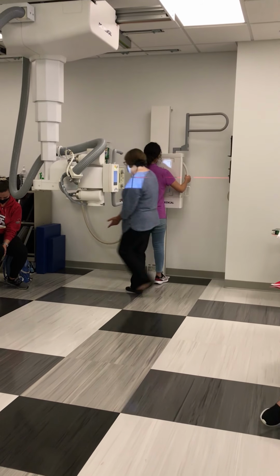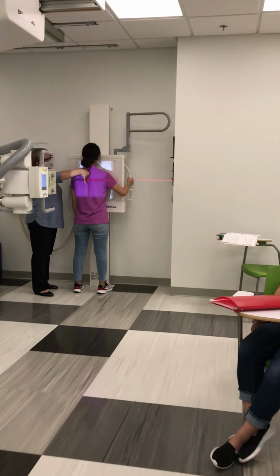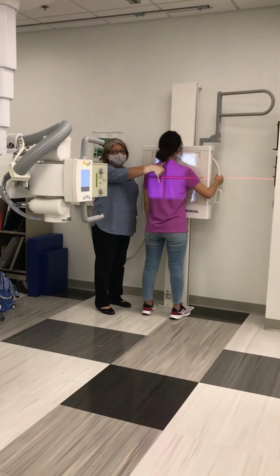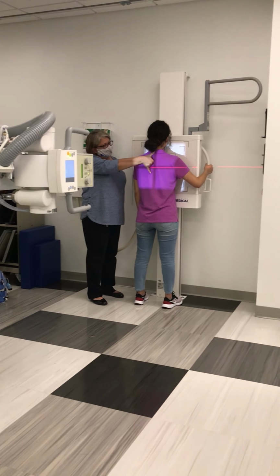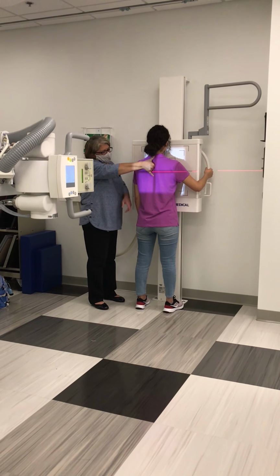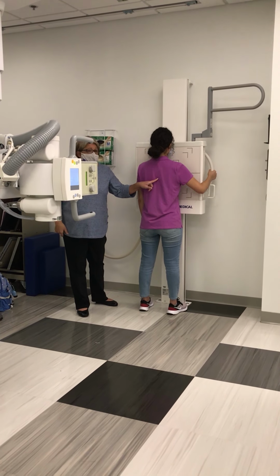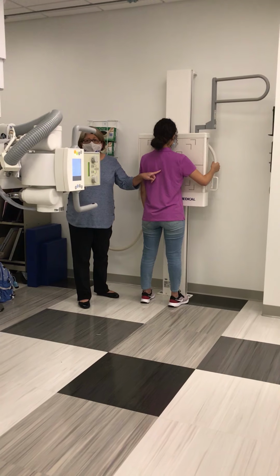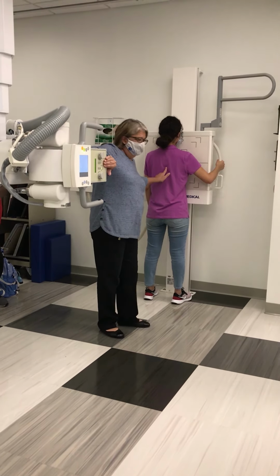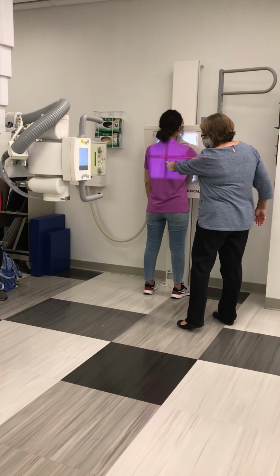Well, one method that I can use is to place my thumb on the patient's vertebra prominence, that's that most prominent spinous process, spread my fingers apart, and my pinky is here. That should be approximately T7. Now these are landmarks that you use, and these are guidelines. So I'm going to bring my tube down to that level.